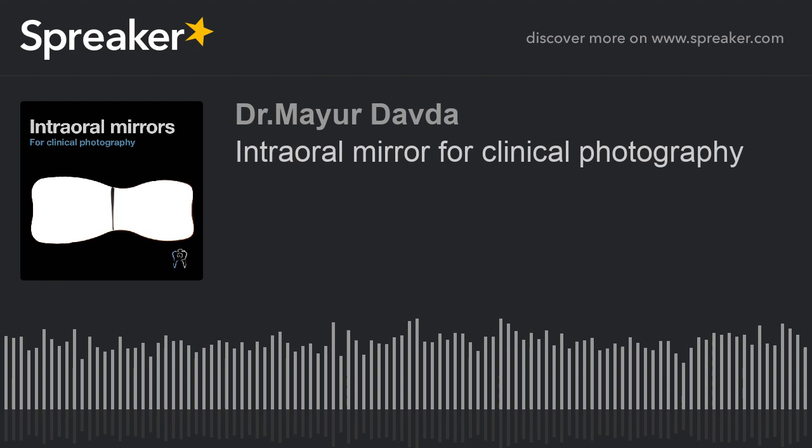Now coming to the last part, there are a lot of mirrors which have an inbuilt fan in them to prevent fogging. As much as I would have loved to use these particular mirrors, I wouldn't like to use them because they require charging. That's an additional workload for me. And the second reason obviously is that they are very heavy as compared to the normal mirrors, and they are very expensive, probably 8 to 10 times the cost of a normal stainless steel mirror.